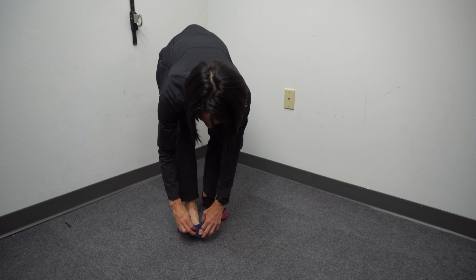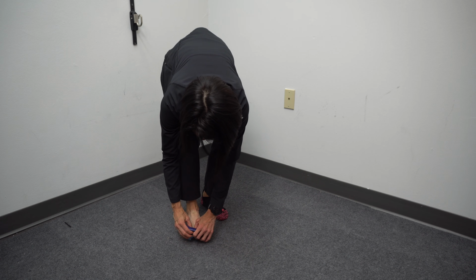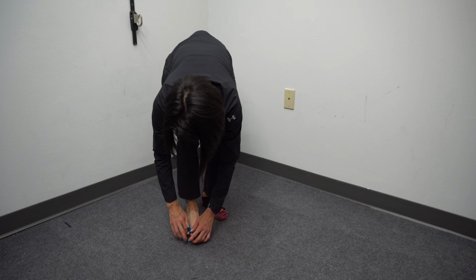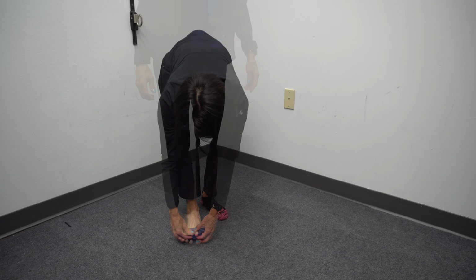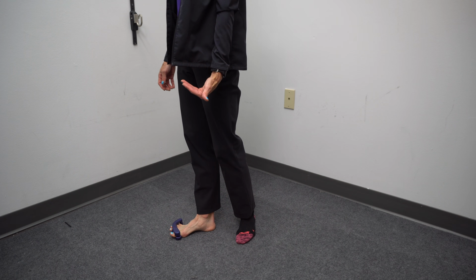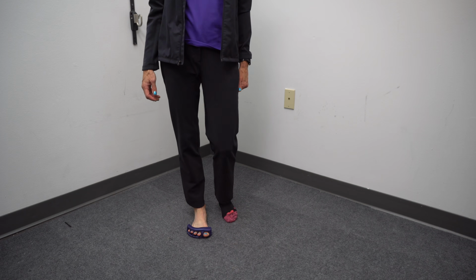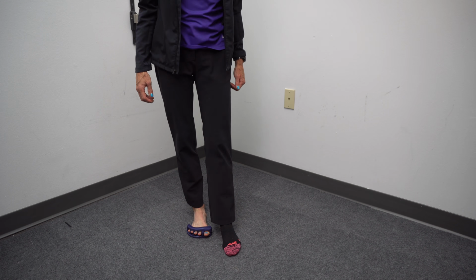And basically you just put this on. And again, I do prefer the bigger one, even though it is a little bit of a pain to get on. You usually do need help to put it on. And the reason I like the bigger one is that it does kind of lift your toes up a little bit as well. And then you can work on loading that leg, doing some forward, backward stepping.